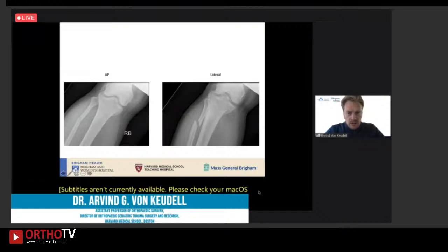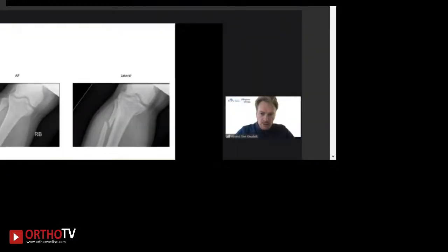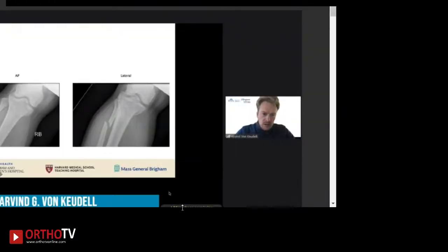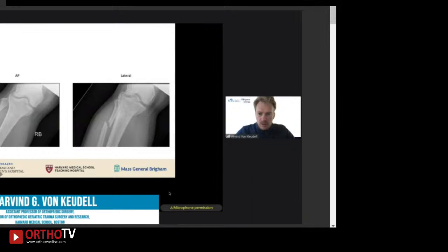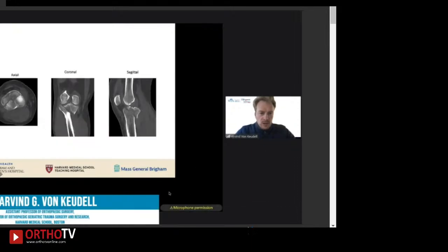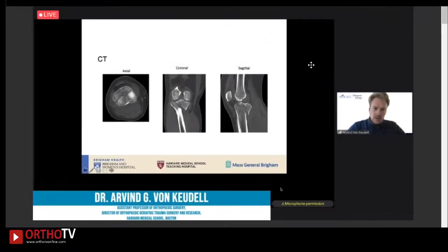Here are his AP and lateral x-rays of the tibia. You can see a fibula fracture, and something doesn't look right with the proximal tibia. So we'll get a CT scan with the three cuts: axial, coronal, and sagittal.